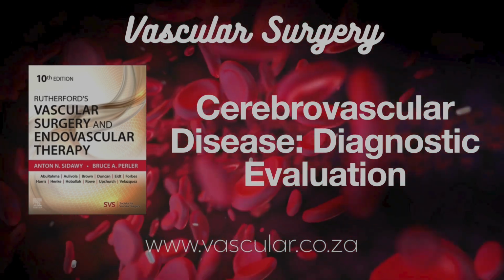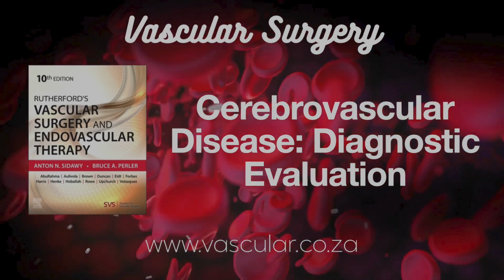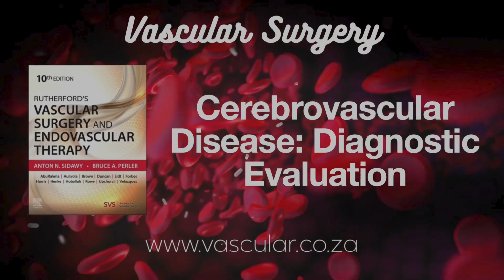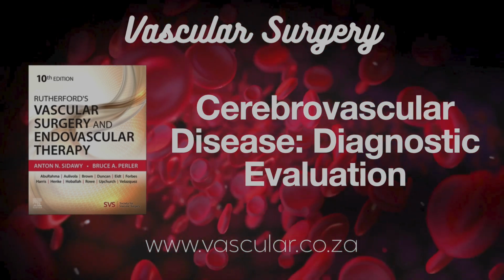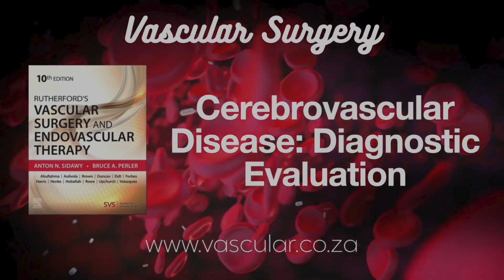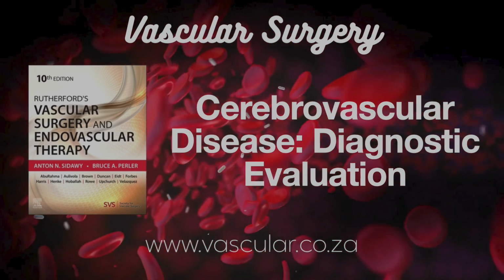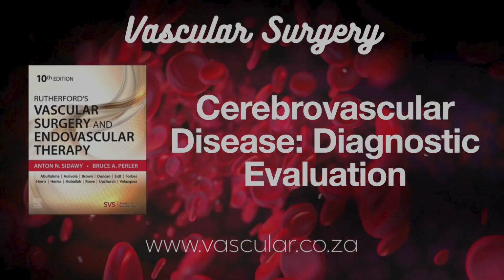No contrast needed there, you said. Correct. That's its biggest selling point, no contrast agent required. It works by detecting the signal from moving blood. It can actually pick up signals pretty well even when blood flow is quite slow. And you mentioned different types. Yeah, there's a 3D TOF technique which gives better spatial resolution. That's helpful for measuring stenosis more accurately and also for looking at flow direction, like in a steal phenomenon where blood is being pulled away from one area to supply another. So, no contrast risk, good for slow flow.